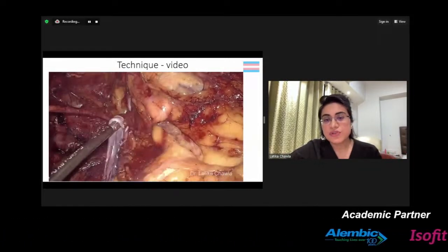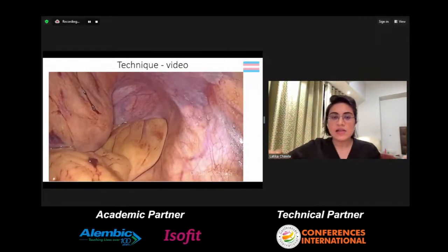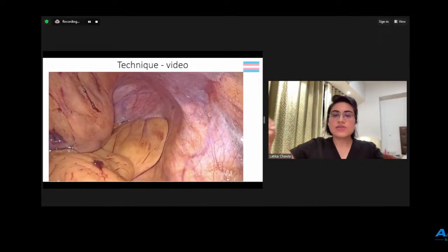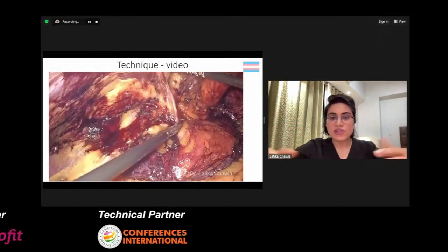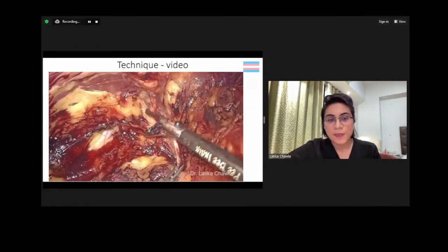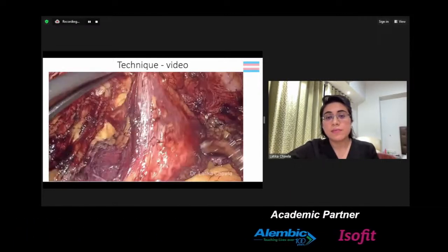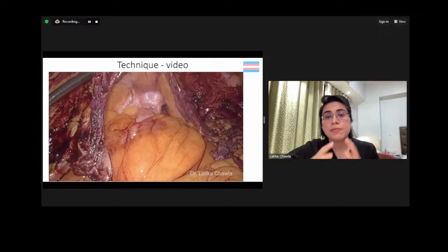Here, we were looking for the ureter and defining the course of the ureter. Now, the ureter, once lateralized, will only enter the bladder in the extreme posterolateral aspect. So, till then, we are safe. We do not have any major vessels as well as the ureter. The third part of the dissection is the dissection of the peritoneum of the bladder.